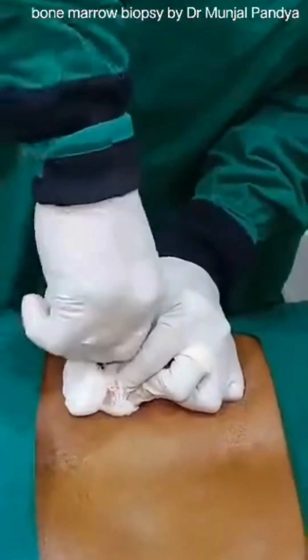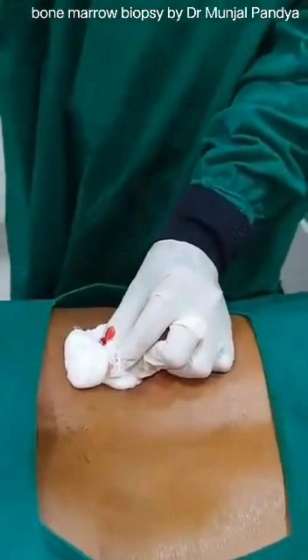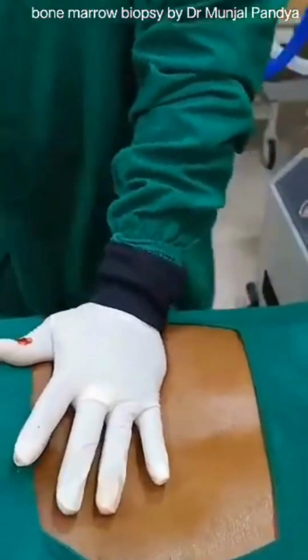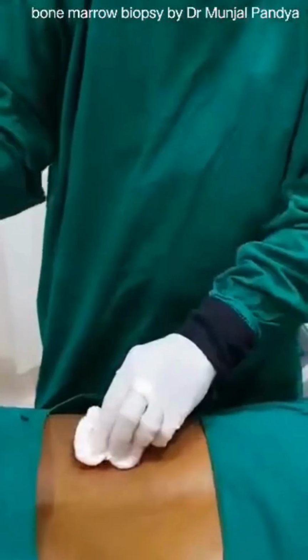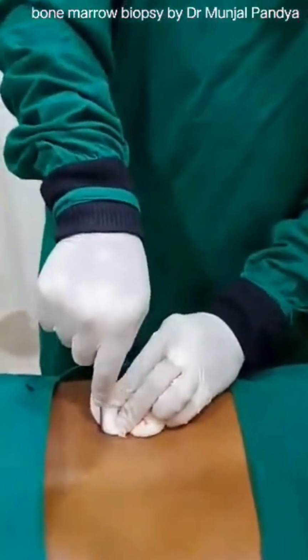We are in the bone marrow. Now I am removing the needle. So this is called a bone marrow aspirate. So once the aspirate is done, after the aspirate, you have seen the aspirate. Now I am going to take a trephine part.